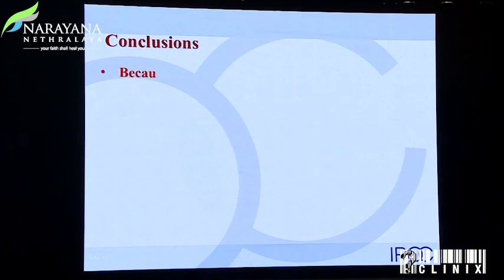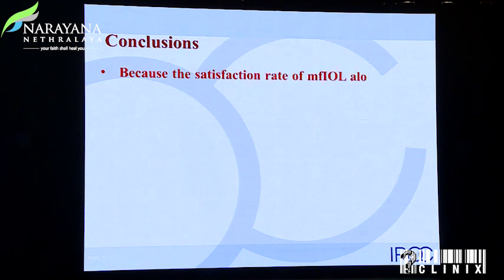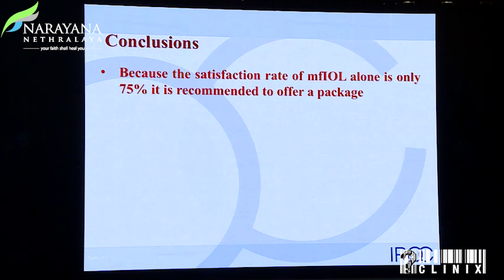In conclusion, we believe that the satisfaction rate of multifocal IOLs has to be improved, or you select your patients very carefully, which you obviously do. Sometimes I'm missing that. Nevertheless, because I'm seeing so many patients, if that selection is not done properly, which in big clinics you cannot do yourself, you may be faced with doing a LASIK afterwards.